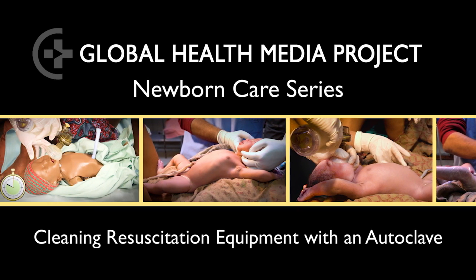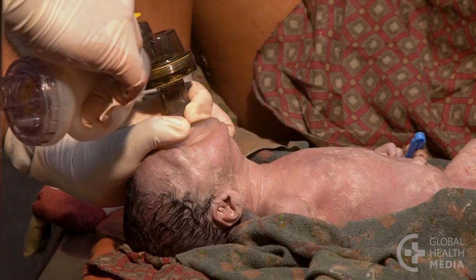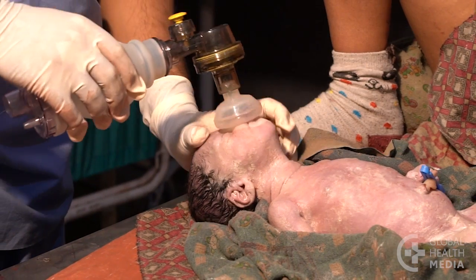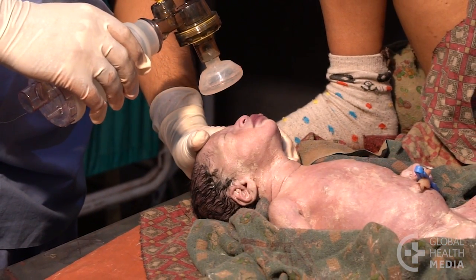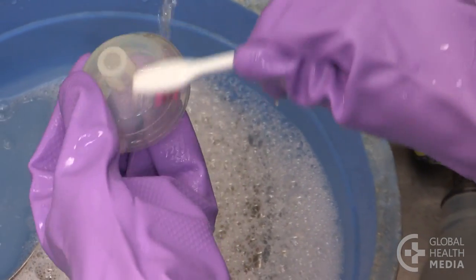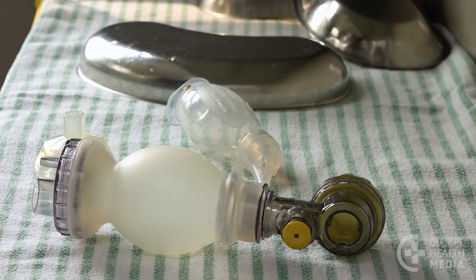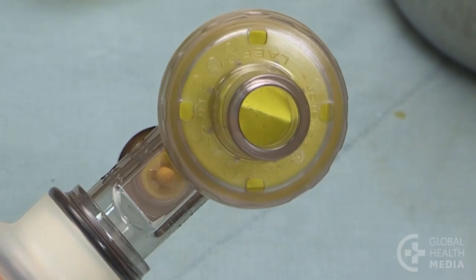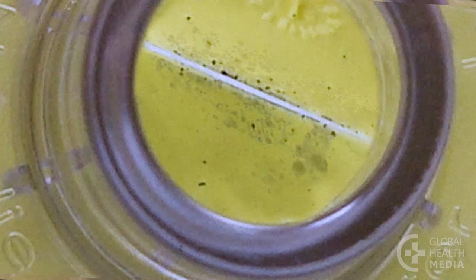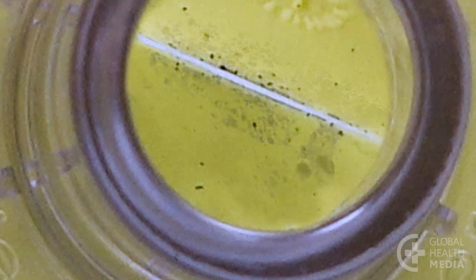Cleaning resuscitation equipment with an autoclave. During use, resuscitation equipment becomes contaminated with the body fluids of mother and baby. If you simply wash your equipment with soapy water and set it to dry, the equipment may appear clean. Harmful germs, too small to see, however, may still remain. These germs can pass into a baby's airway, leading to infection.